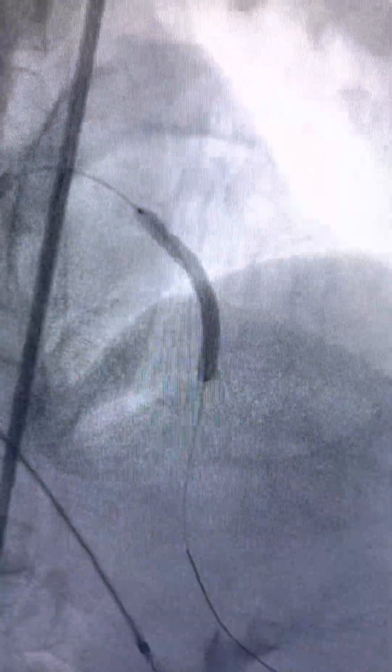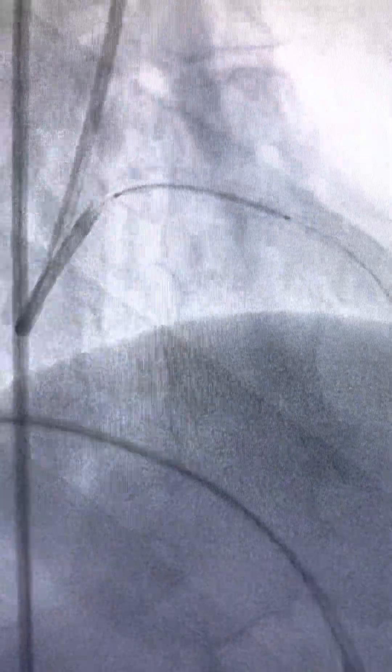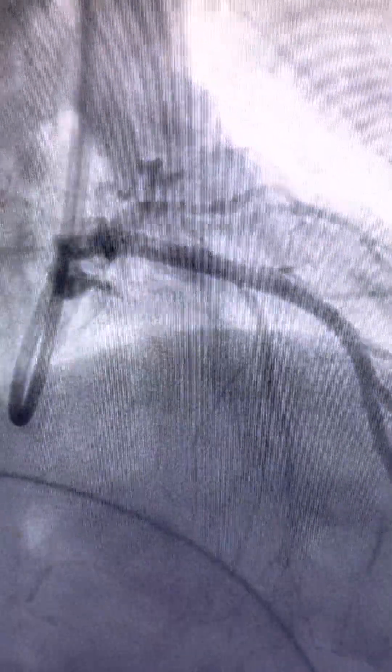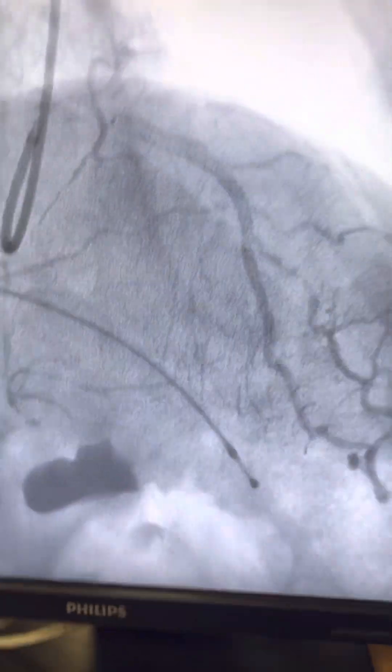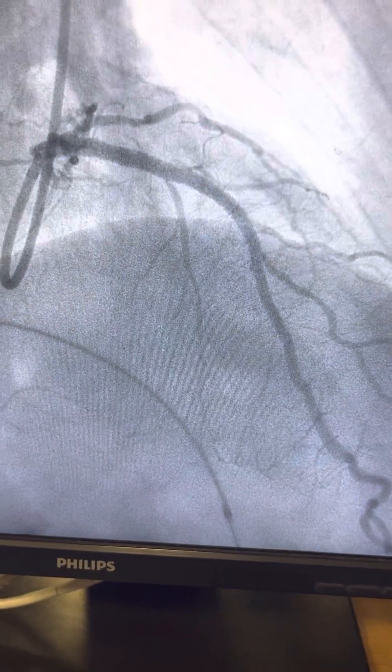You can see that when you inflate the stent, expansion is good. I'm inflating the second stent — this is post-stenting, I'm doing post-dilation. Results are extremely good; we can see there is good expansion of the artery.